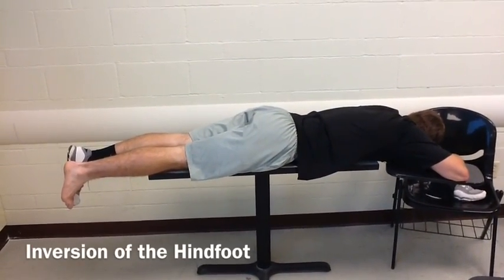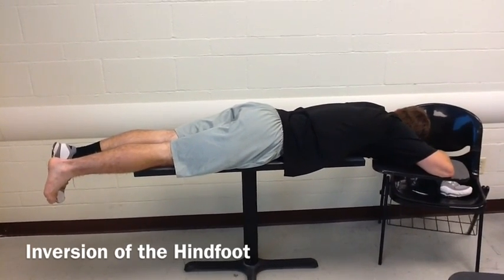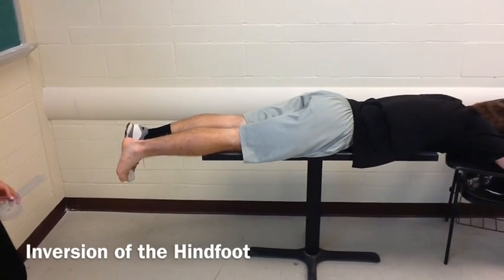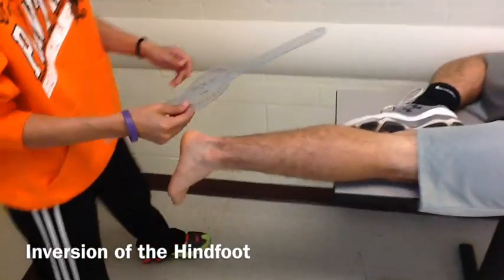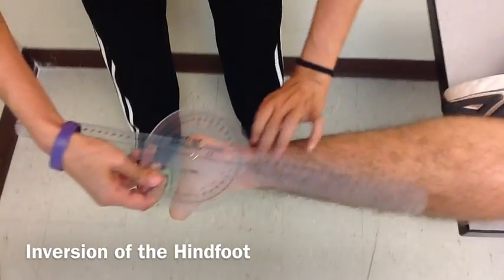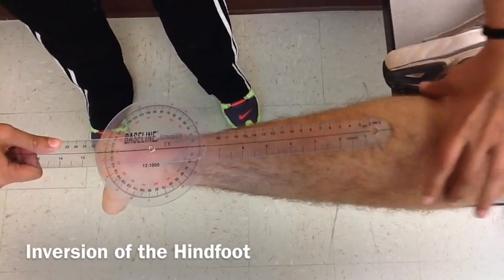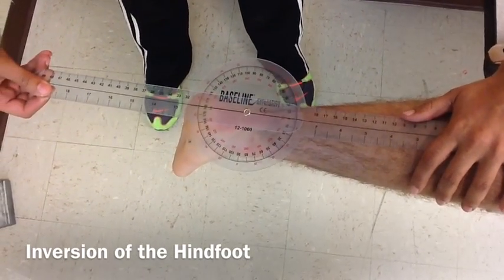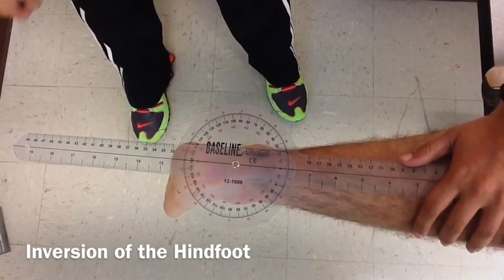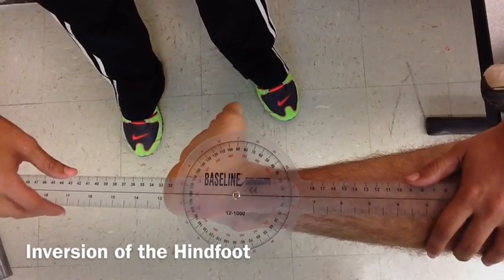Now we will be measuring inversion of the hind foot. Have your patient lay prone with their foot hanging off the table. Place the fulcrum of the goniometer between the two malleoli on the back of the foot. Line up the stationary arm with the midline of the leg and the movement arm with the midline of the calcaneus. Then instruct your patient to point their foot inwards and measure their range of motion.